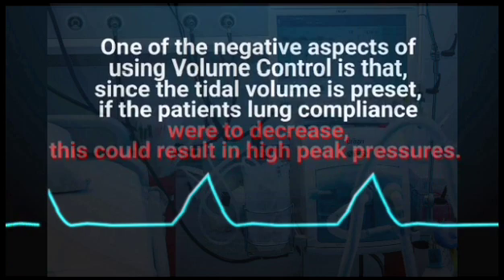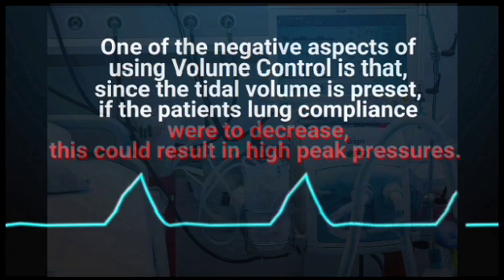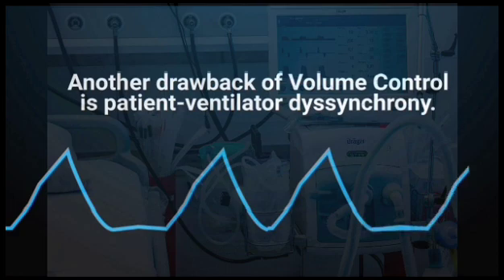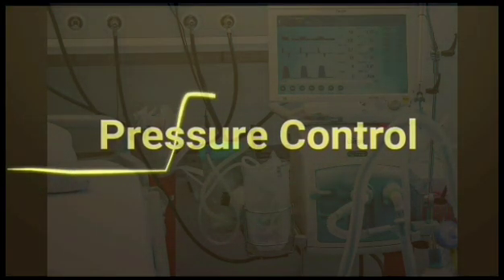One of the negative aspects of using volume control is that since the tidal volume is preset, if the patient's lung compliance were to decrease, this could result in high peak pressures. Another drawback of volume control is patient-ventilator dyssynchrony. And then there's pressure control ventilation.